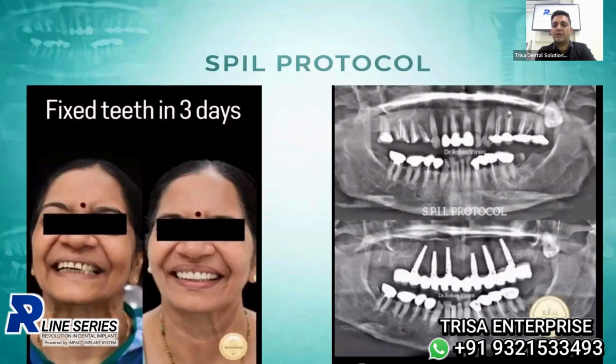So let me share with you the first case of SPIL protocol. Now here, if you see this lady with the problem with the upper jaw, we have placed 6 two-piece DSI implants in immediate load protocol.